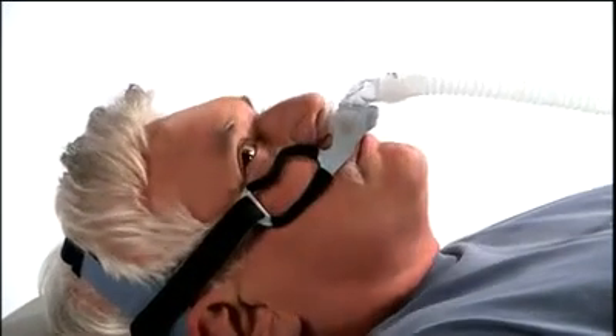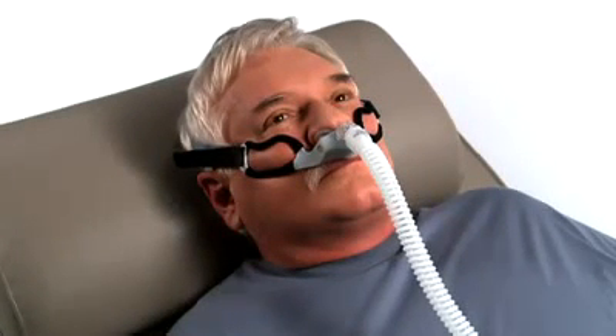Turn on the airflow, lie down, and breathe normally through your nose, keeping your lips closed. With your therapy pressure at the prescribed level, turn your head from side to side and identify areas of leak that may prevent the ability to sleep.